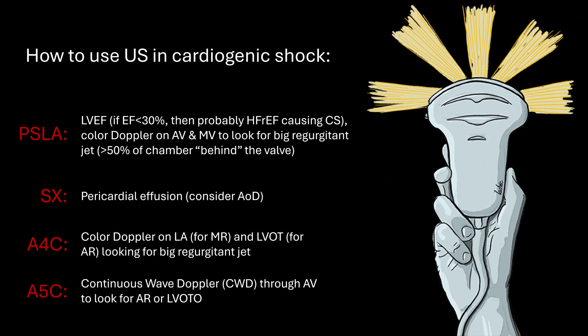This is how I use POCUS in cardiogenic shock. I start in the parasternal long axis view and look at ejection fraction. If EF is less than 30%, they probably have HFrEF causing cardiogenic shock. I'll also put color Doppler on the aortic and mitral valves to look for a big regurgitant jet — remember, greater than 50% of the chamber behind the valve with a wide vena contracta is hemodynamically significant. Then I move to the subcostal view to look for a pericardial effusion, which would make me consider an aortic dissection. Then I move to apical 4-chamber with color Doppler on the left atrium and LVOT, and finally to apical 5-chamber with continuous wave Doppler through the aortic valve to look for aortic regurgitation or LVOT obstruction.